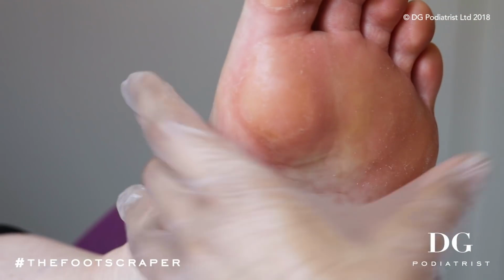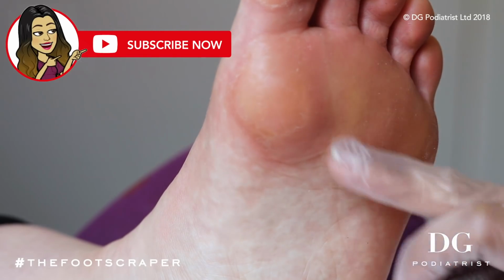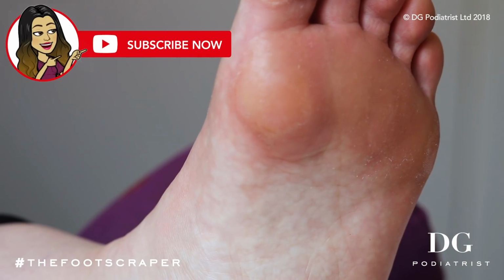Perfect. So we've tackled the main areas of concern. You do have a little bit of callus that's sitting in these areas. They're getting far too thin for the scalpel to remove. Right, okay.